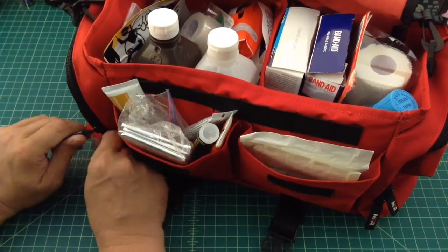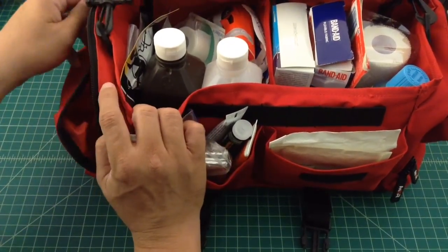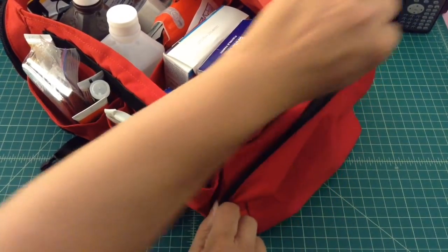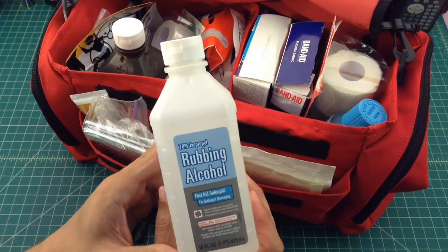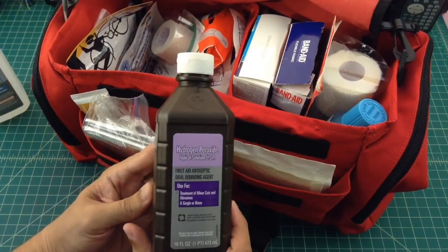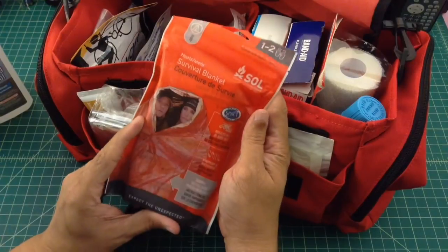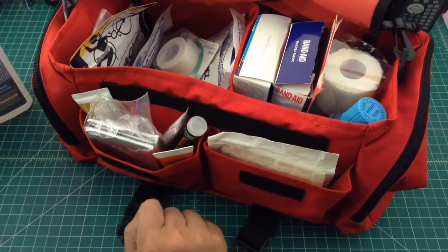Let's go to the side pocket — there's nothing in there. The other side pocket — nothing in there either. Moving to the main compartment: rubbing alcohol, which makes sense if you need to clean or disinfect something; a little hydrogen peroxide for the same purpose. And I have one of these survival blankets in case somebody's in shock or needs to warm up — that's a little bit better than the cheap space blanket we talked about earlier.